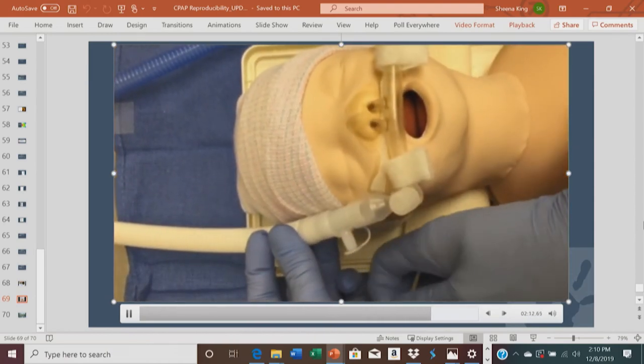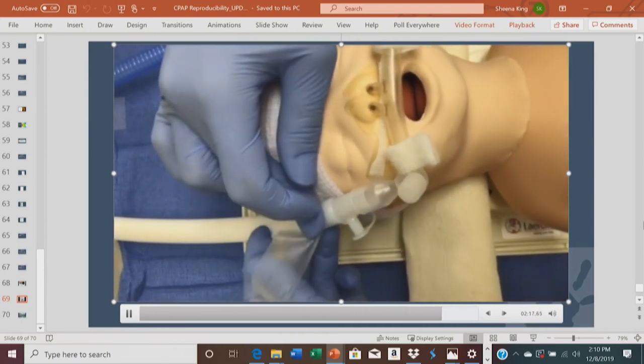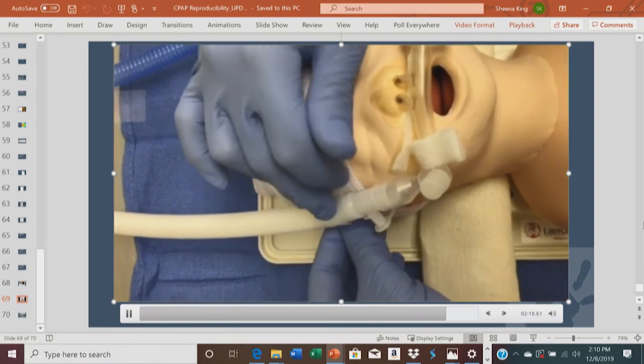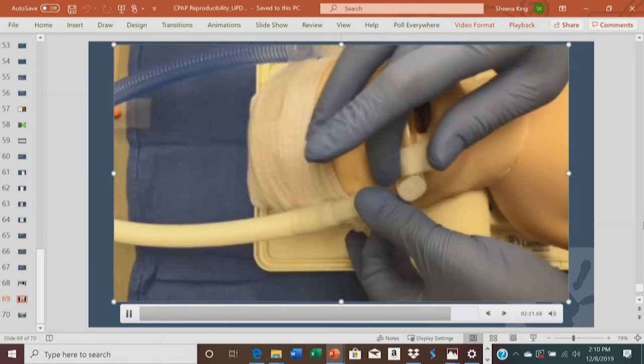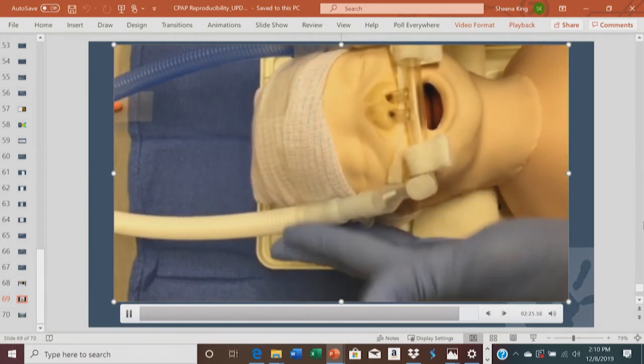Supporting it with our hands, we make sure that the tubing is outside of the baby's eyes. Then you gently tape the tubing to the hat. Make sure the tubes are positioned not on the frontal lobe, but closer to the ears.